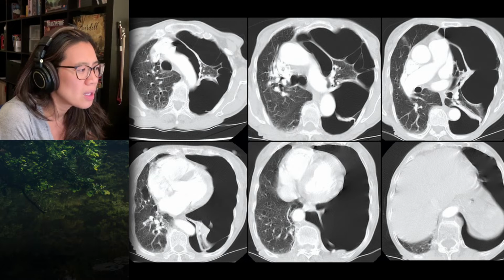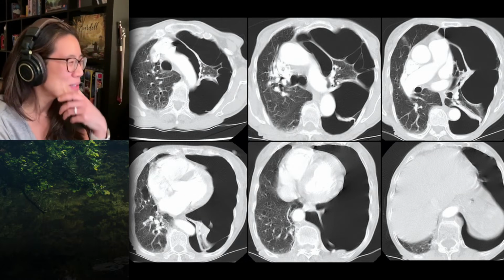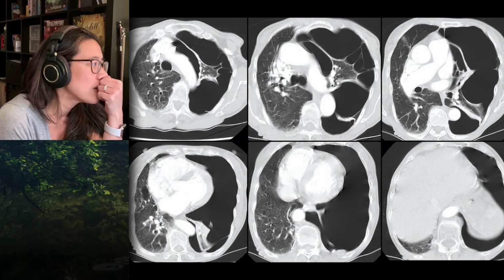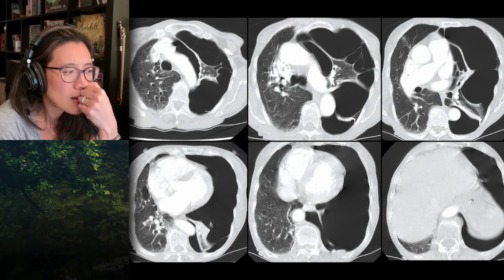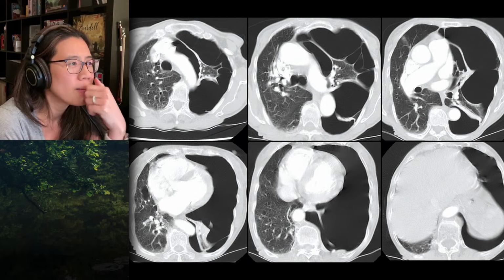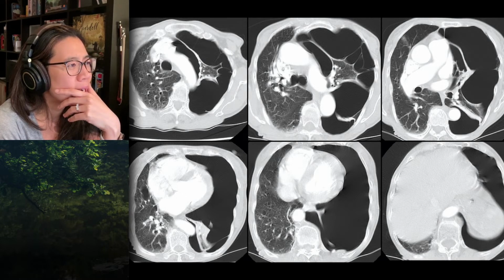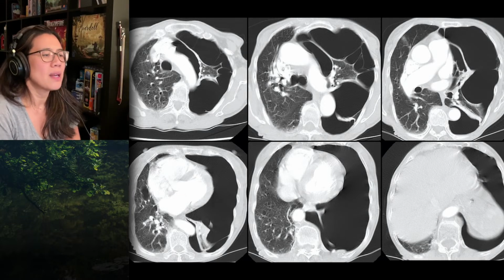So here's your CT scan. Oh, that didn't help. Well, the mediastinum is shifted to the right. Is it under tension? If the mediastinum is shifted, there's tension, whether it's in those cysts or in the pneumothorax, whichever you're going to call it. But the fact the mediastinum shifted, with big black, means there's some sort of tension. Right. So is it a pneumothorax or are they big bullae? Does it matter?